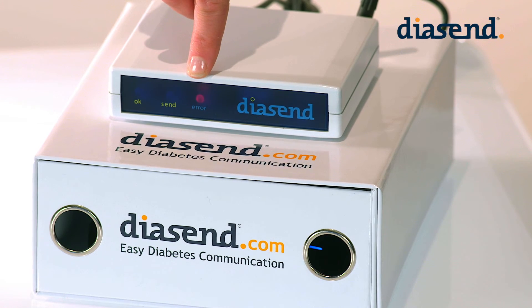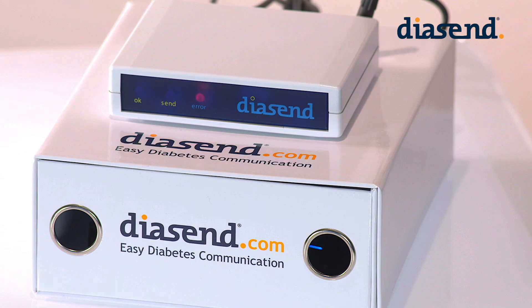If the red light comes on, please try and upload the pump again. This could happen if the pump is moved or if it falls down. You don't need to restart the transmitter.